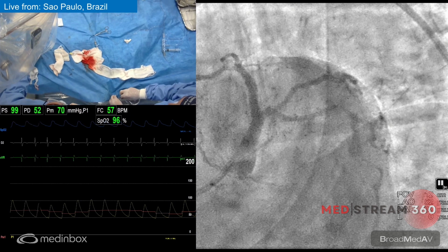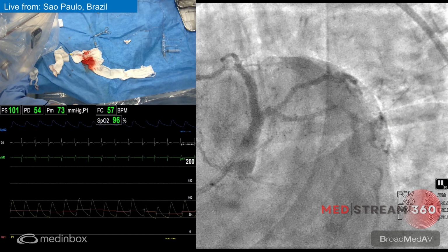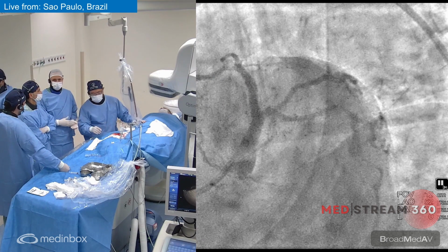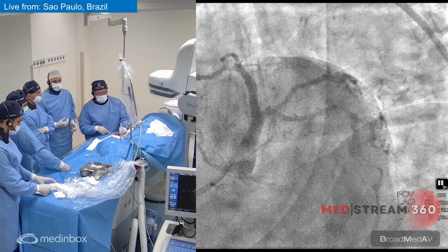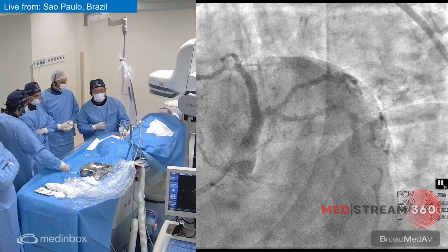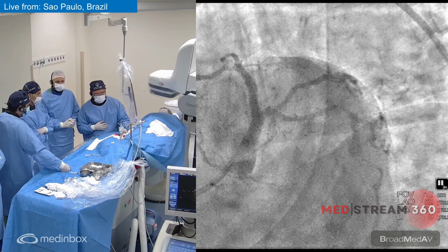Opening of an occluded ostium LAD involving a left main bifurcation. This patient had a multivessel disease, already had a subocclusive in-stent restenosis in the RCA, which was treated first. And now I think has a complete revascularization and has all the potential to have a very good clinical follow-up. So congratulations to you, Louis. Congratulations for the very nice tips.